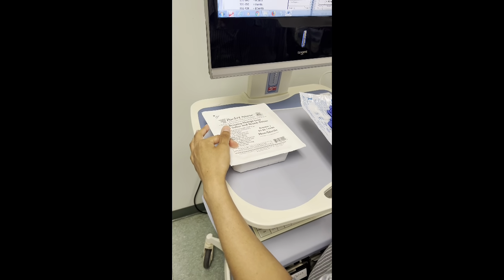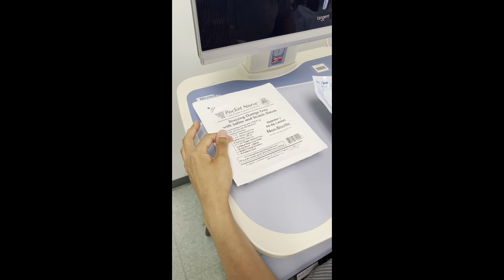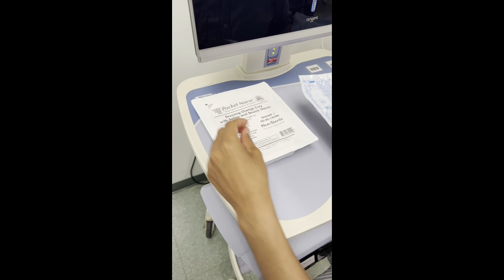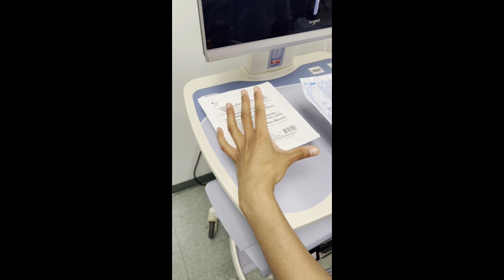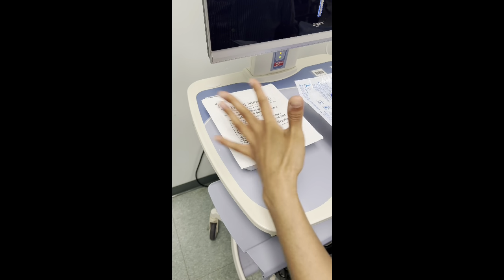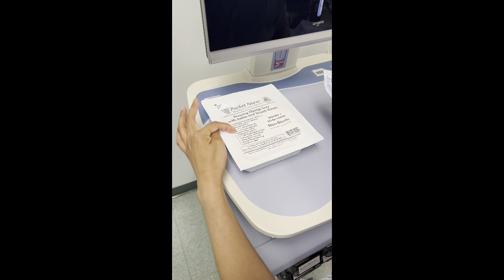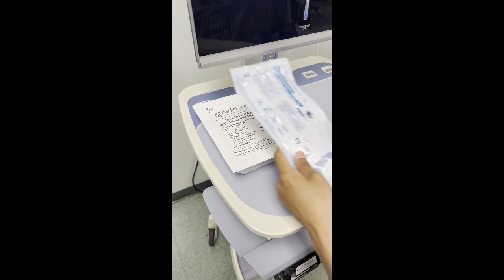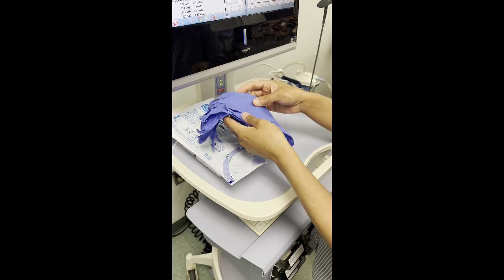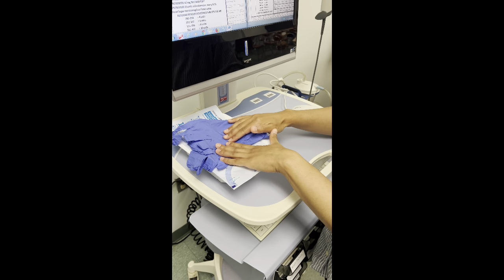It should also have the ID patient label, tape, and forceps. And there's also a clear measuring sheet, which you would be using if you need to measure the incision site. And that's pretty much that. And we also have sterile gloves and 2 pairs of non-sterile clean gloves.